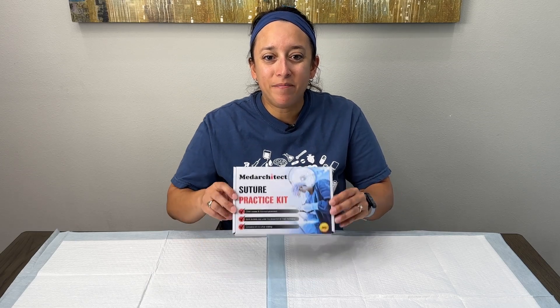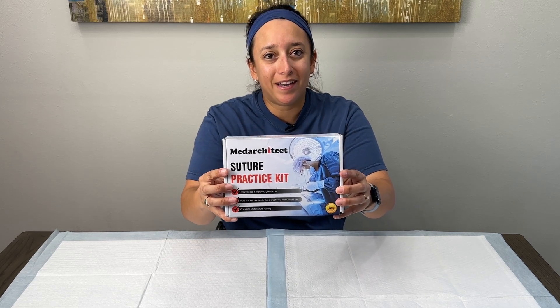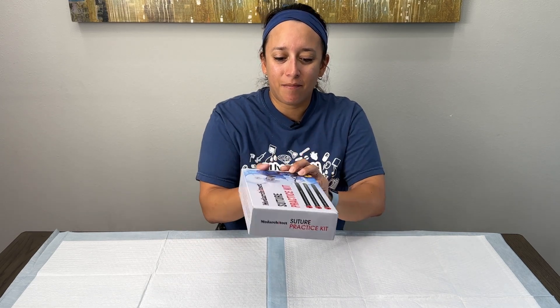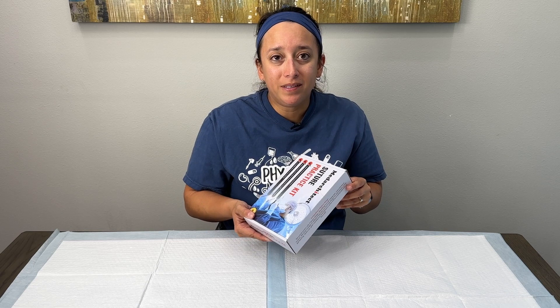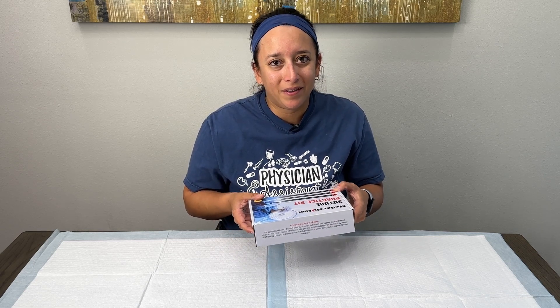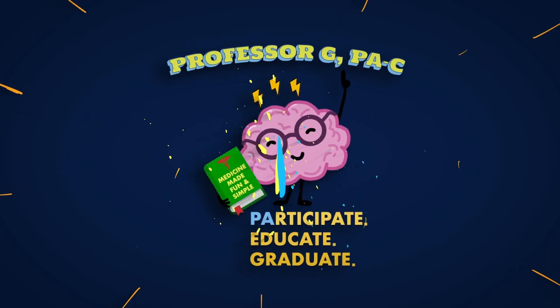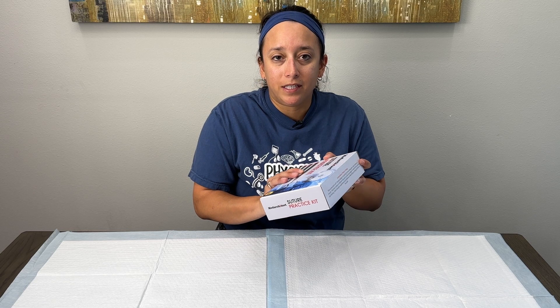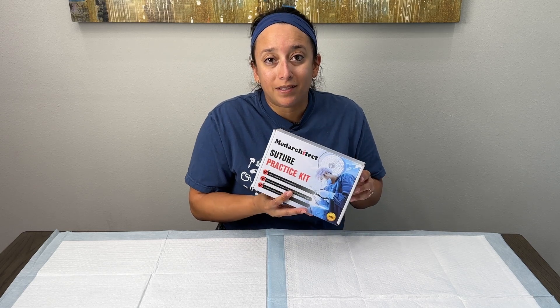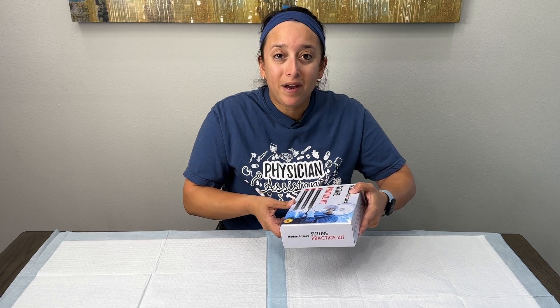Today we're going to be doing an unboxing of the Med Architect suture practice kit that you can get on Amazon. We're going to open this up, take a look at what's included, and I'll give you my opinion on the kit. We want to thank the folks over at Med Architect who sent us the suture practice kit so that we can review it here on our YouTube channel.